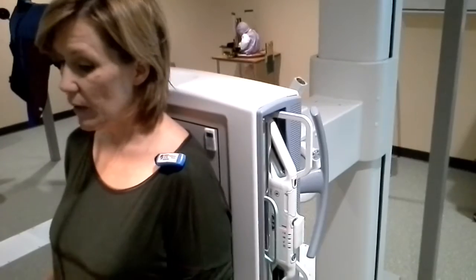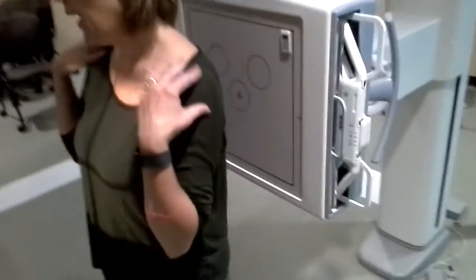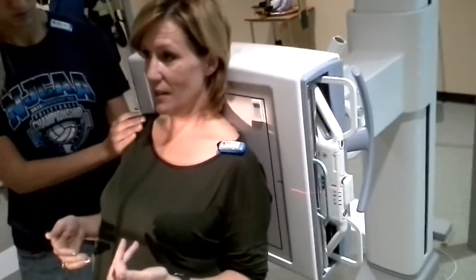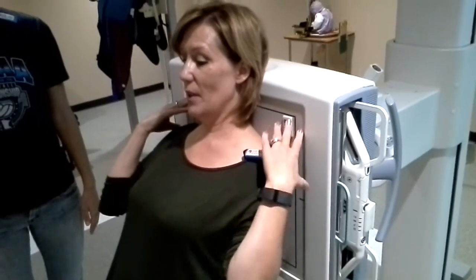Okay. Now if the patient's able to, I would just ask them to take a step forward, and then I guide them. So like I would have, yep, just like that. Now I'm just going to have you lean back. So just help them lean back, because that's kind of scary to lean back like that. It's like that trust fall, you know, when someone's going to catch you. You want to make sure that that board's going to be behind your back.